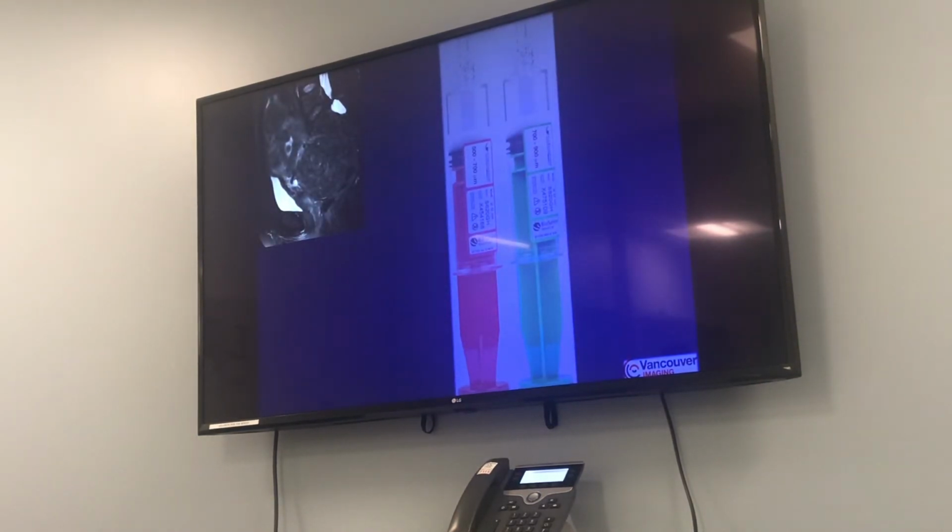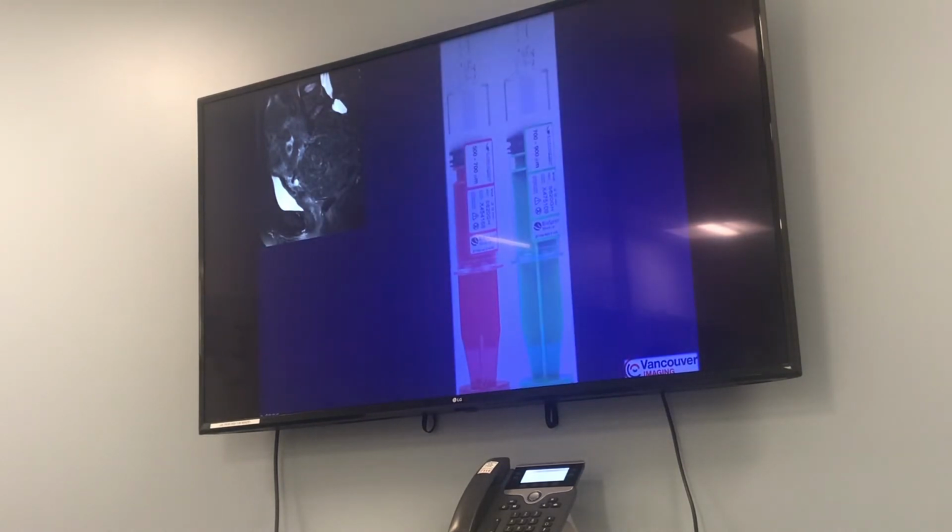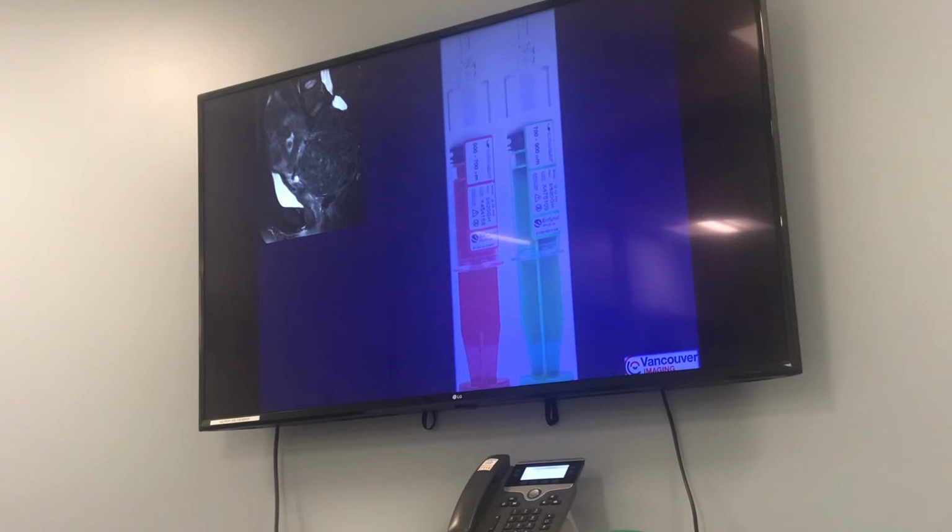So this is, again, a patient who's got lots of fibroids. You can see here, and actually, this little white thing here is the endometrial cavity. She's got a little fibroid in her endometrial cavity, and that will probably just slough off and she'll pass that. And you can have quite big fibroids in the endometrial cavity, and those will often slough off, and the patient will feel like they're giving birth because they're literally delivering a fibroid. So it can be quite distressing as well.